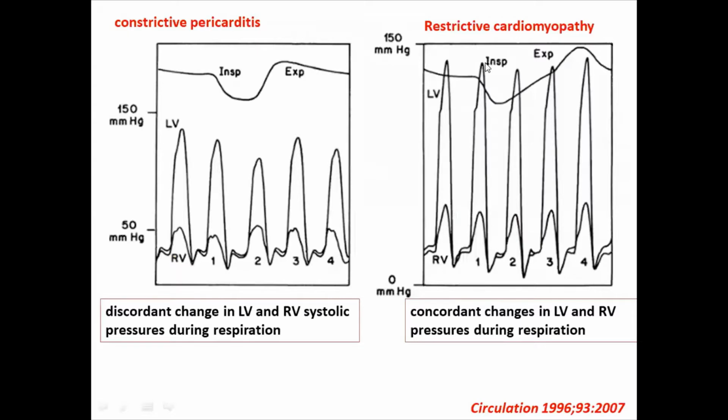Who can just hear the diagnosis is written? I just want you to describe what you are seeing. Diagnosis is written here. Okay, and the constrictive pericarditis is simultaneous hemodynamic tracing between the LV and RV. So this is left and right heart catheterization. We said one of the indications is to differentiate constrictive pericarditis from restrictive cardiomyopathy.